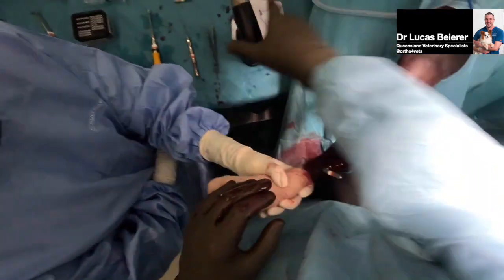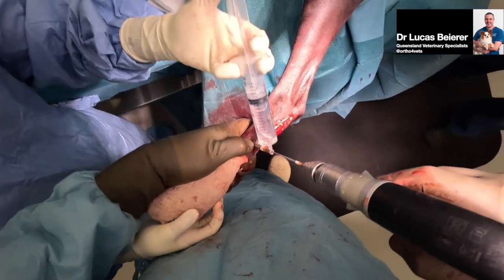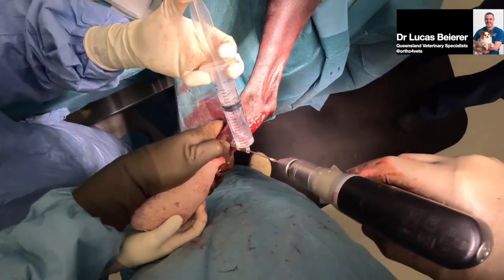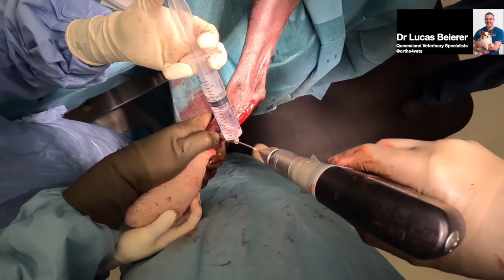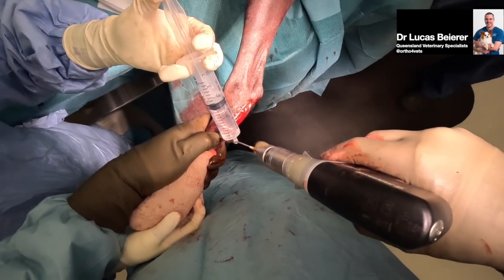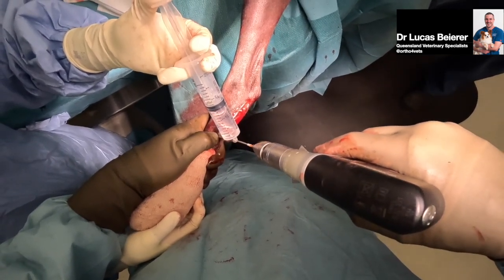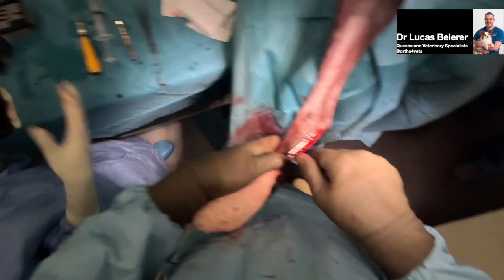Do you place this off in tranexamic acid? No, I don't think so. Do you think we should? No, no. We haven't done that for a long time and had success. I don't know if it's really possible. I don't think we need that across all the toes.